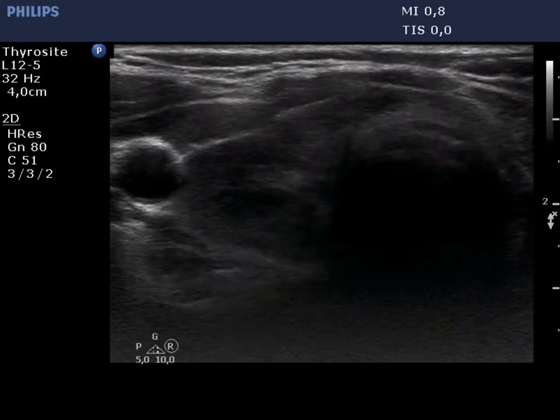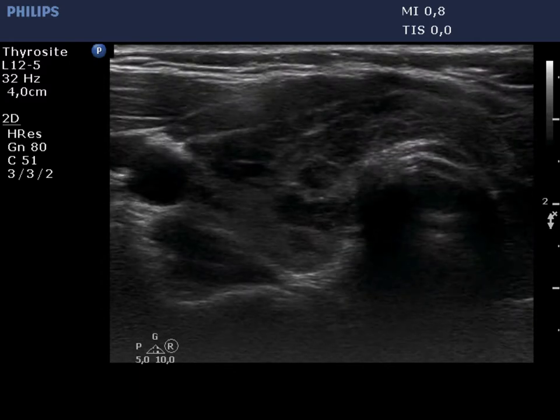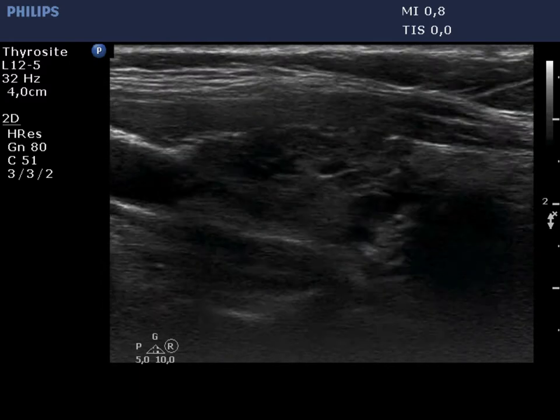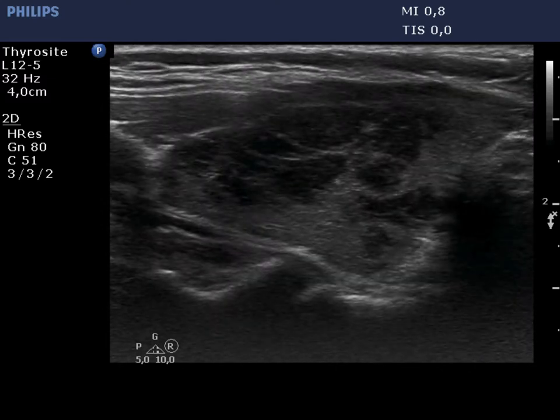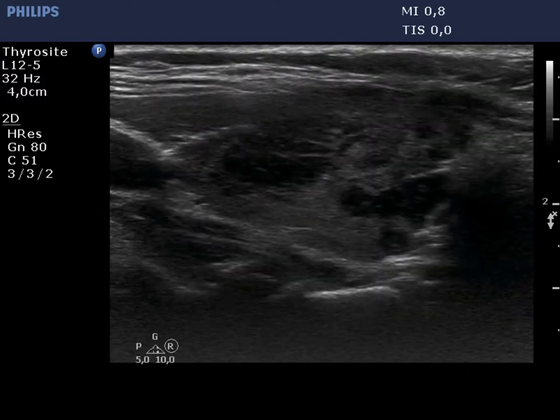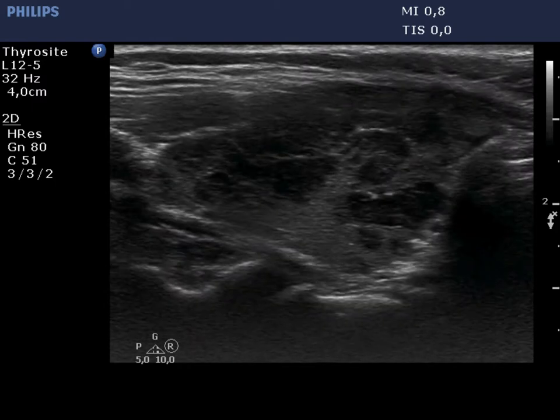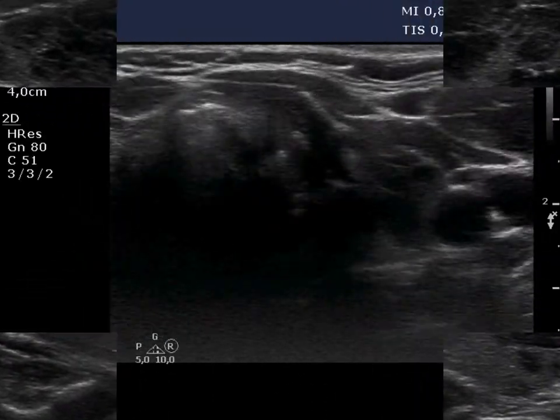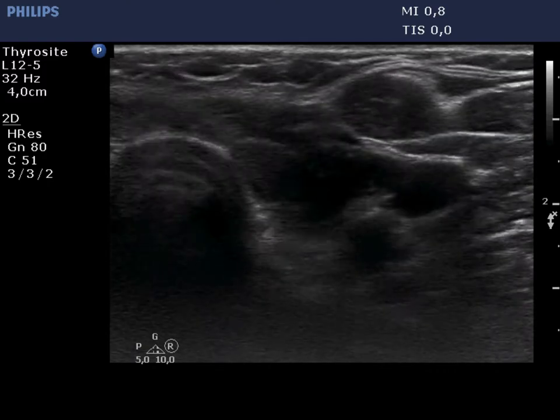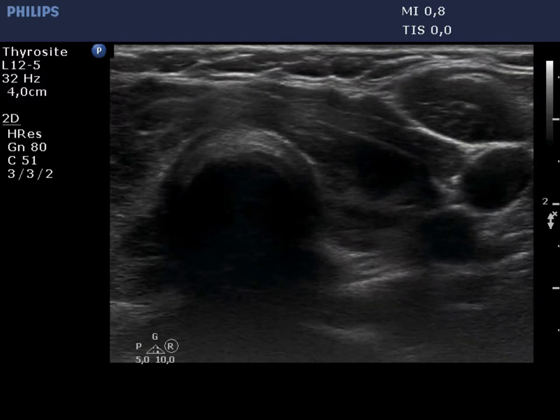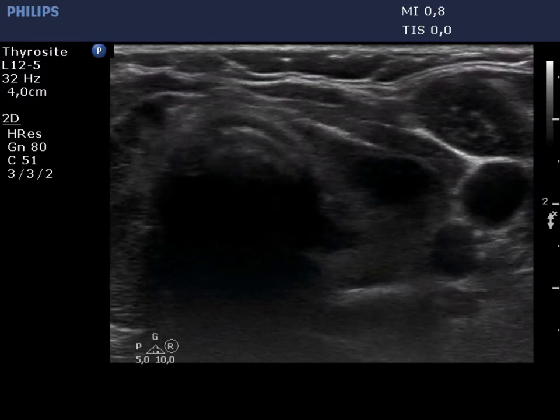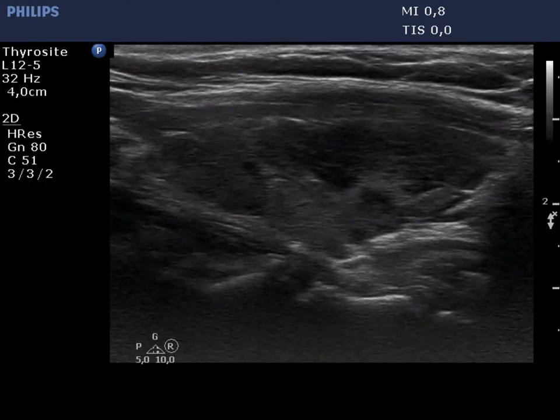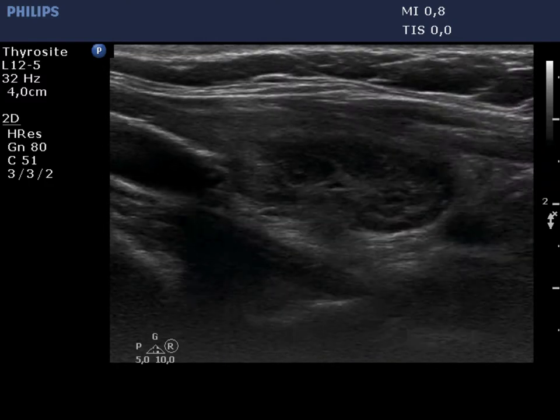The thyroid is minimally hypoechoic and has numerous hypoechoic foci. The latter have irregular shape and present echogenic lines corresponding to connective tissue. The left lobe has an identical presentation. None of these irregularly shaped hypoechoic areas fit a nodule in the pathological sense, but they are more active foci of thyroiditis.